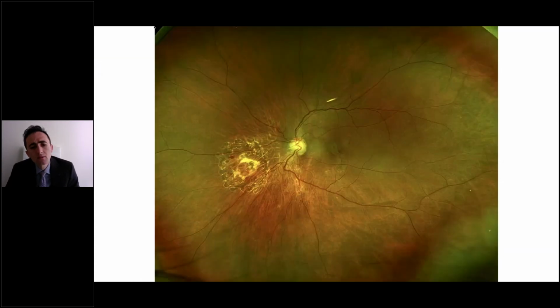I wanted to show this example of a recent case I did for a neurosensory retinal transplantation where we borrowed a piece of the retina nasal to the nerve to fill in the defect or a macular hole in the center part of the macula. And with these new advances, you always think, do I want to burn the whole periphery of the retina with heavy laser, or do I want to leave a triangle or a small area of viable tissue in case we need it for transplant in the future or for any other implications?